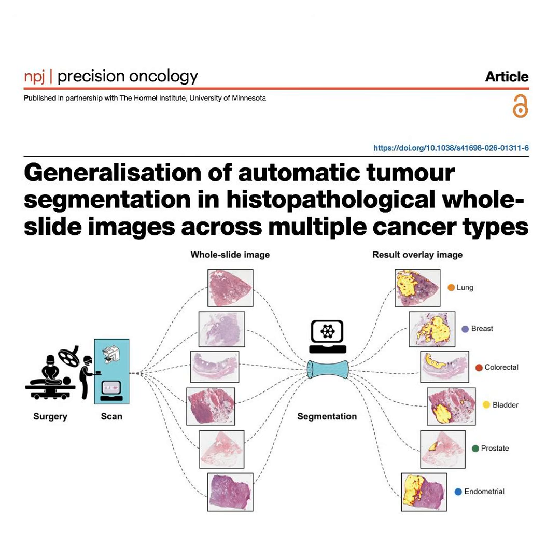But if I'm trying to teach a machine a universal rule, I can't just dump raw hospital data into a server. Right. Absolutely not. You have to be incredibly strategic about what types of cancer you include. So what did they choose? They anchored the training data on 4 specific carcinomas. So that's colorectal, endometrial, lung, and prostate cancer. Okay. But doesn't that introduce an immediate problem? Oh, it definitely does. Because in the real world, and in these raw data pools hospitals have, you might have, I don't know, thousands of samples of lung cancer, but only a tiny fraction of that for endometrial cancer.